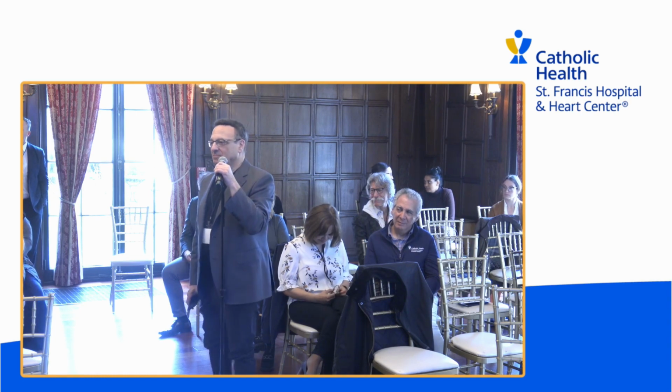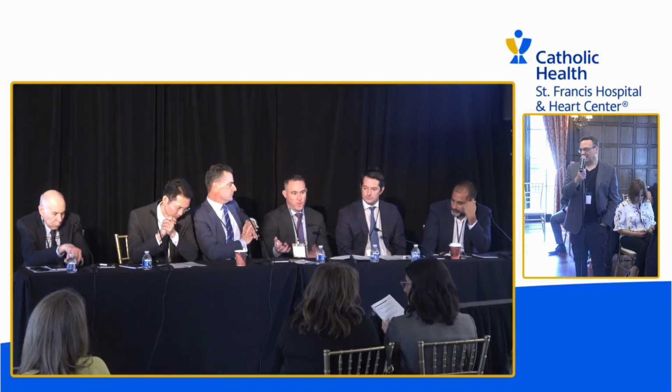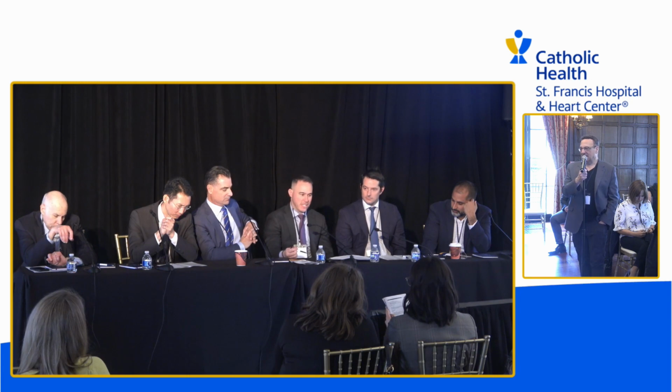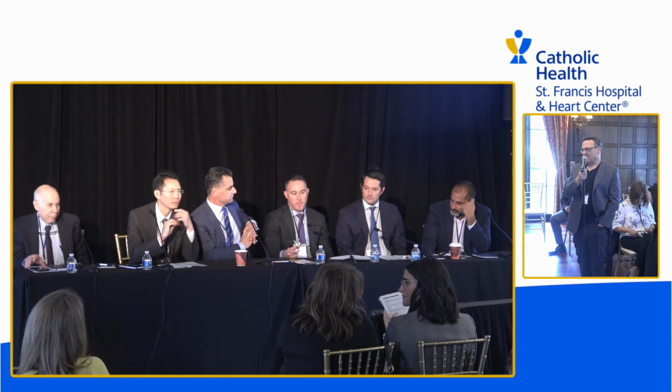I actually have a question. You were probably involved in the planning for this case. Tell me about valve selection, Evolut versus a Sapien valve. So when we see something like this where this patient had a very large amount of annular calcium, the one thing we don't want to do is balloon the valve initially. We really don't want to balloon the valve at all, which is why they chose a 20, which kind of just kissed the edges of the valve and didn't do much. But going with the balloon expandable valve in somebody like this who is 91, if he does suffer a complication like a root rupture or something like that, his chance of having that repaired successfully and doing well is not great. But a self-expanding valve here fits his size.